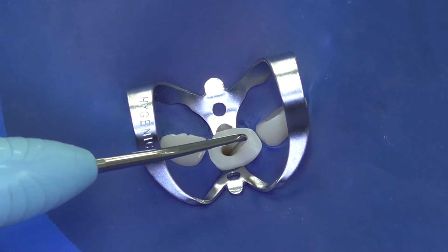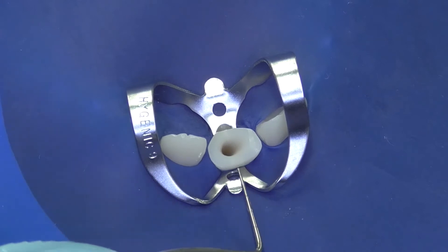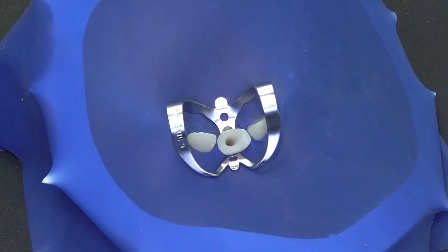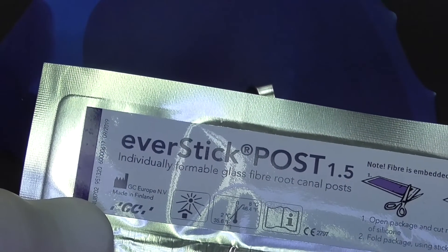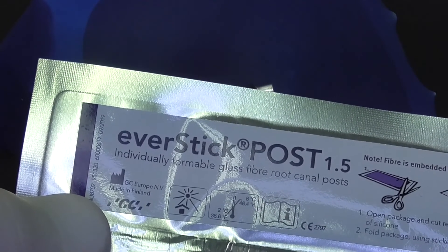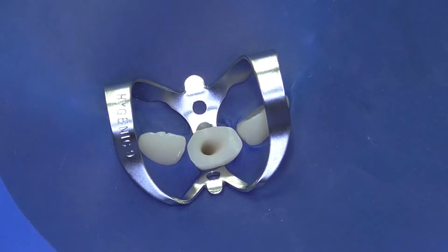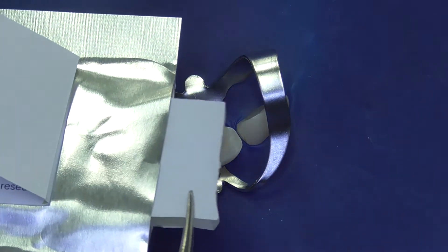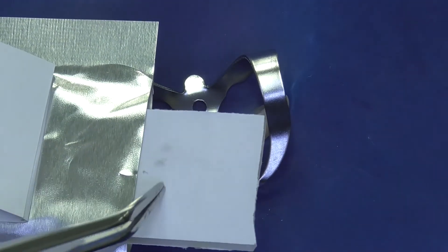Length of the post is approximately the length of the clinical crown. The start of the preparation for putting fiber post, EverStick post from 1.5 mm in diameter, starts with cleaning the root canal and then preparing the post material for insertion.